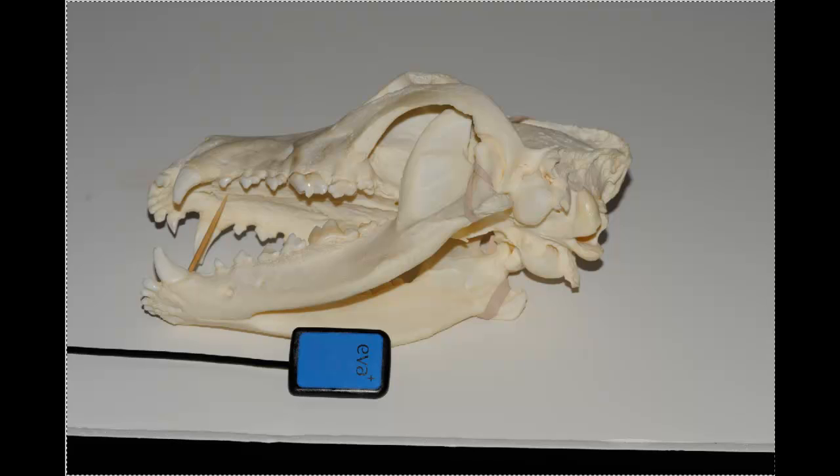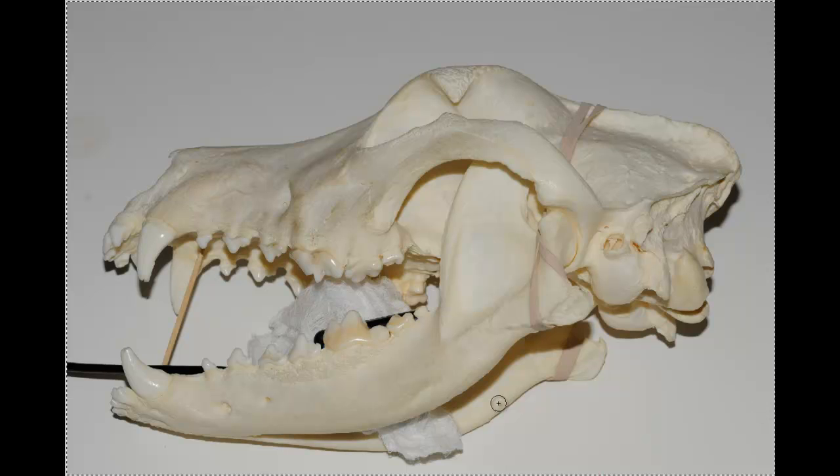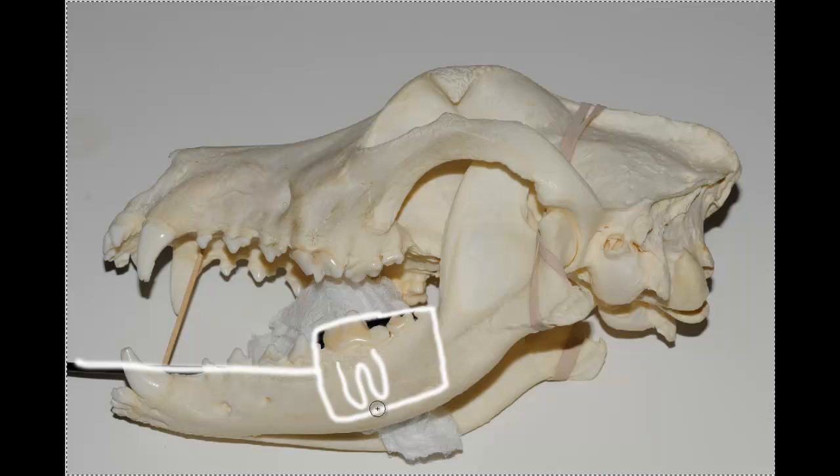So starting off on the mandible, you can see the sensor is placed all the way back and as far down as we can get in order to hopefully get the apexes of these teeth. Now, the challenge to this particular technique is not to do with any geometry or angles because everything is fairly parallel in this area. The challenge here is to keep the sensor down.